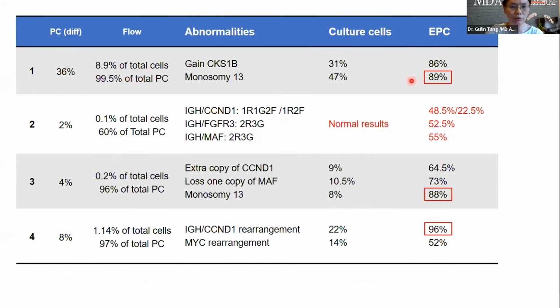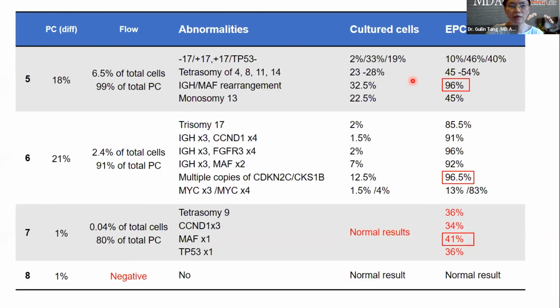This is so important sometimes for the subclone. If it's so low, you might not see it, like in this one, right? Even though we counted 1.5, it's below our cutoff, so we have to call this a negative result. So it's very important to detect in the high percentage. We know this is true, right? So this is the one we run side by side.